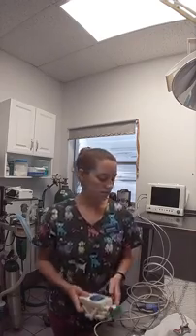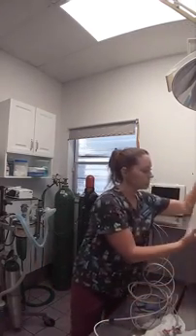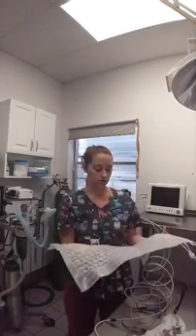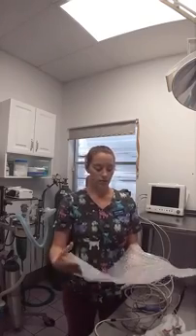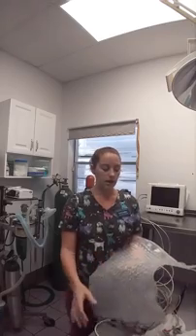A lot of times the patient's temperature is going to drop under anesthesia, so you want to have heating devices on hand. One of the heating devices we have is a hot water blanket. We turn this on prior to the patient's surgery or prior to putting them under anesthesia, so that it has time to warm up. Then we put it on the table, put a towel down, and the patient gets put on this, so that the patient isn't on the cold table and is nice and warmed up.